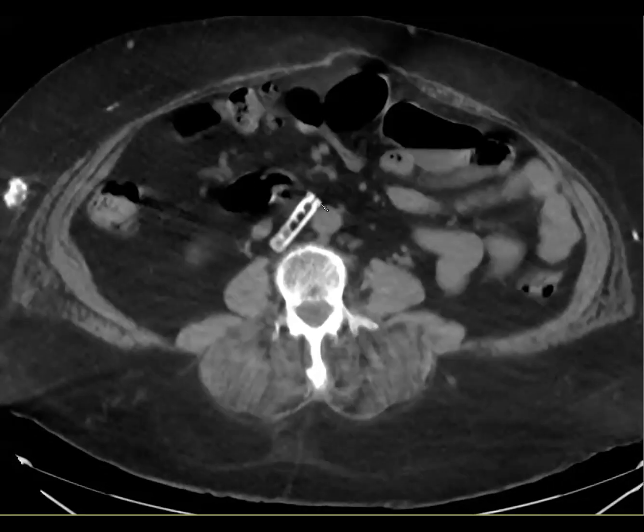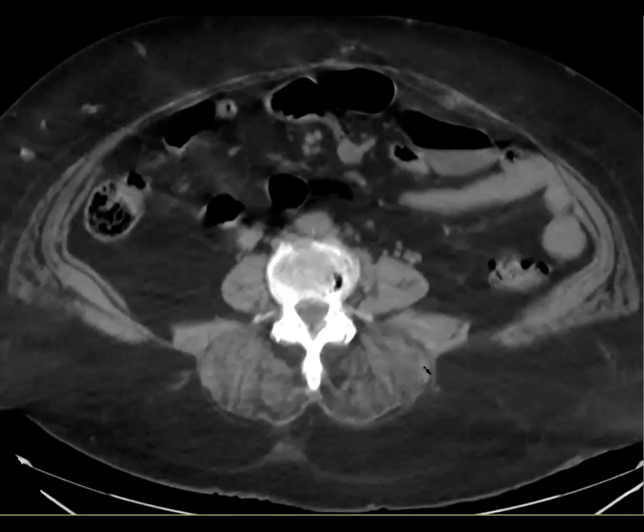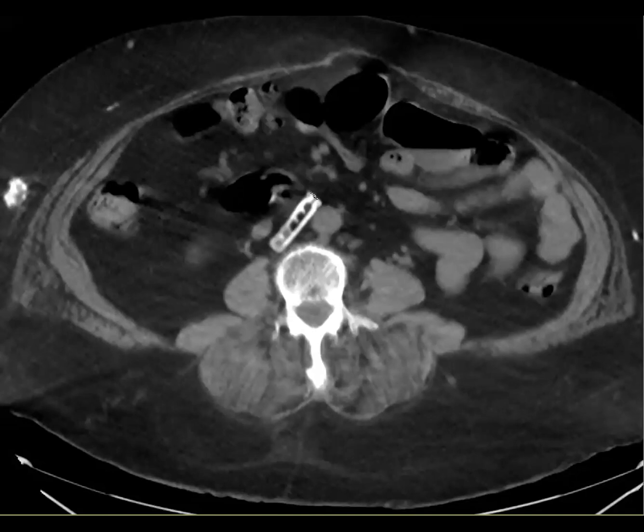Because you're suddenly cutting off IVC return to the heart, it can cause sudden cardiac decompensation. And generally it can cause severe lower extremity edema. So luckily they later invented intravascular IVC filters. But some patients in the 60s until the 70s were getting these IVC clips. So just so you know that they exist.